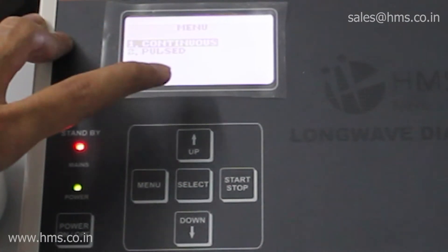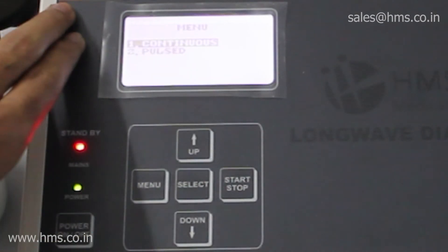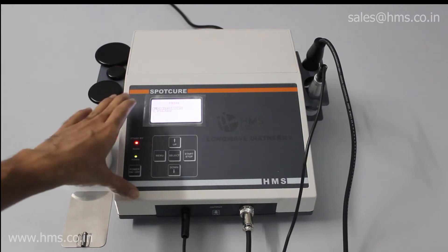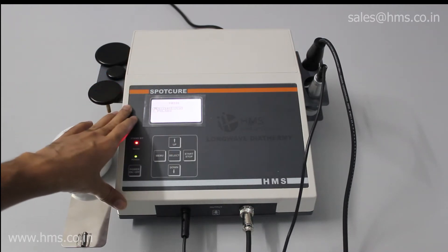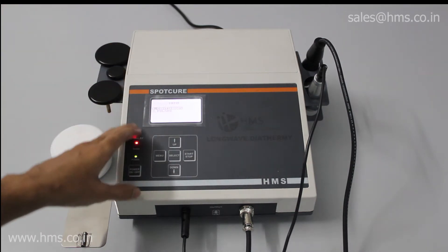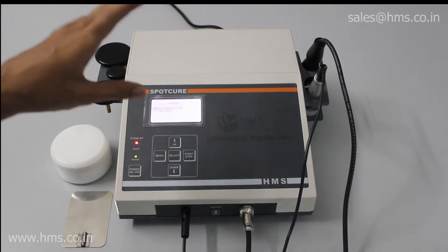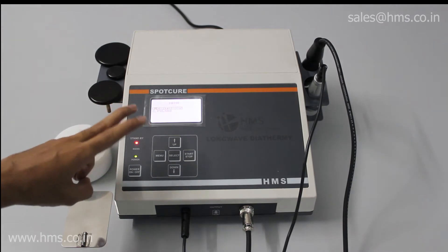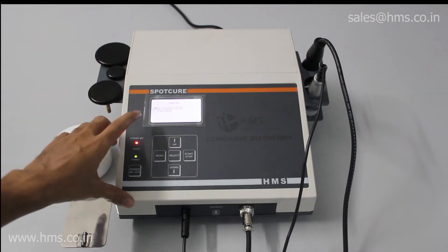There are two different modes — continuous and pulsed — with this Spot Cure. One important thing to note is that this Spot Cure has only capacitive mode. There is no resistive mode available as of right now, but we are working on it. So as of now, this Spot Cure has only capacitive mode, and within that there are two different modes: continuous and pulsed.